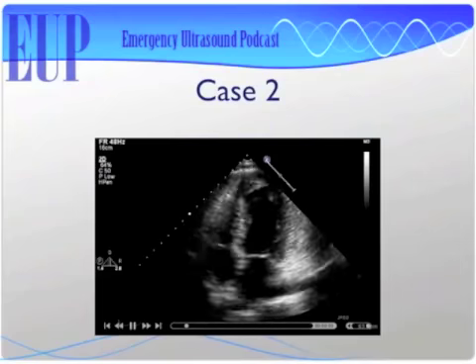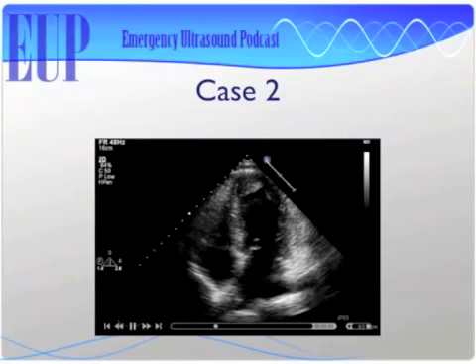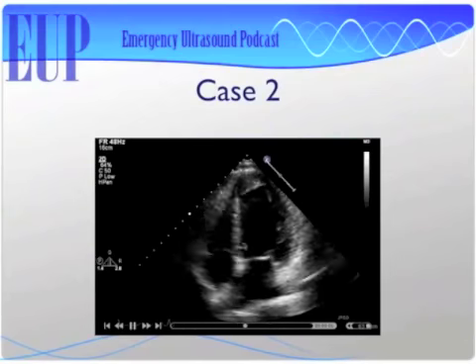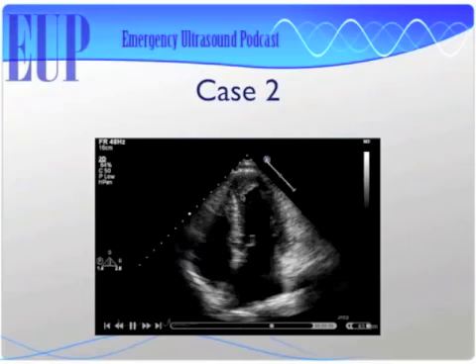So this looks like an LAD lesion based on the fact that the apex is what's really down. Now, there might be a little bit of hypokinesis down on this side here, which would be sort of our circumflex distribution. But man, I'm telling you, this basal septum here, which is RCA, this looks awesome. It's getting after it. Yeah, RCA is kicking butt, man. But LAD is way down and not looking happy.